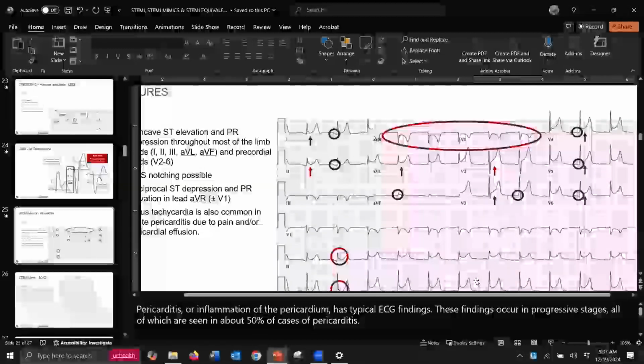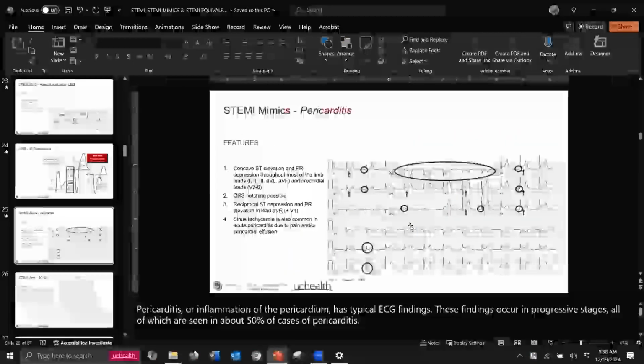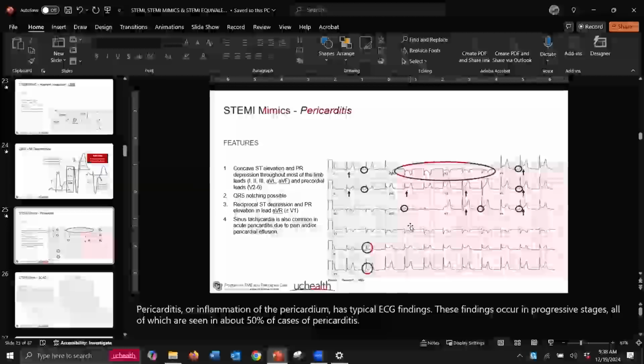And that literally is that fluid, that effusion in the pericardium, being sloshed around, if you will. But its lack or presence doesn't mean a whole lot in the end, right? We need a lot more labs and diagnostics. We need an ultrasound. We need a cardiologist, and we may need a cath lab. Okay.